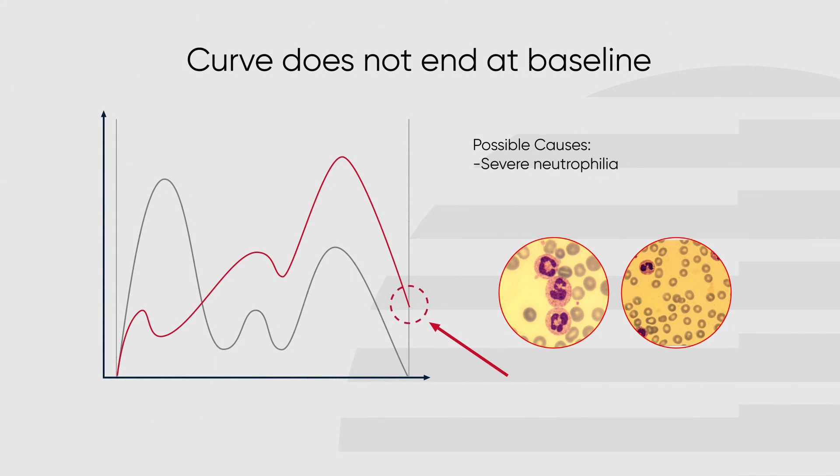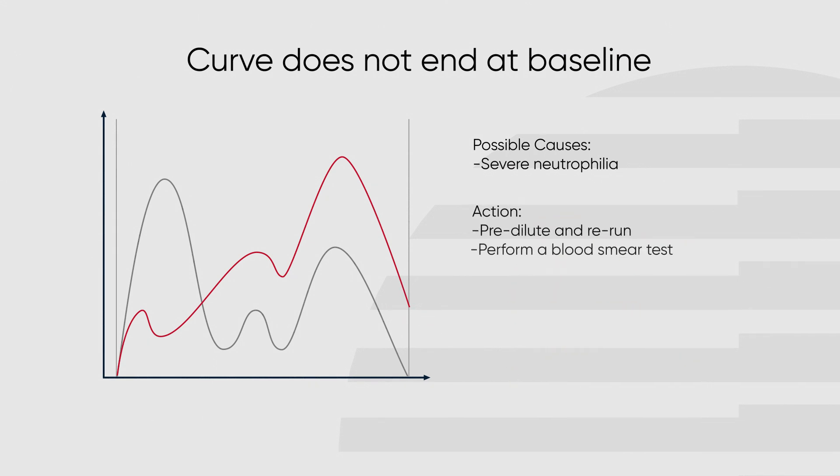If this occurs, pre-dilute the sample and rerun, then proceed to check smear.